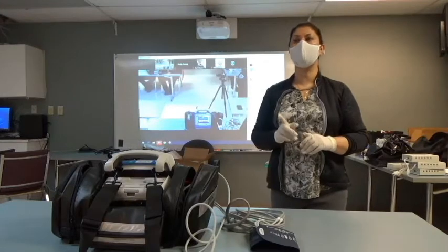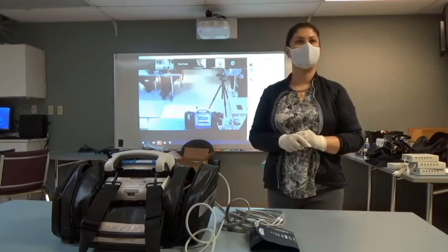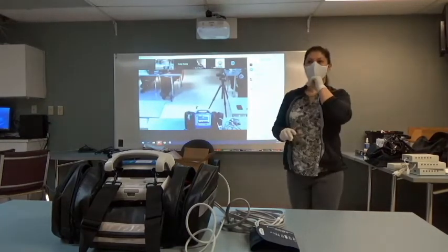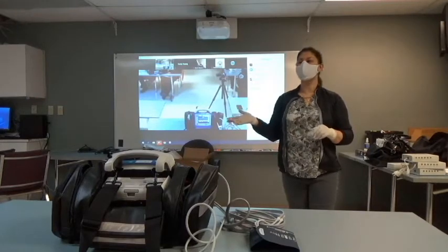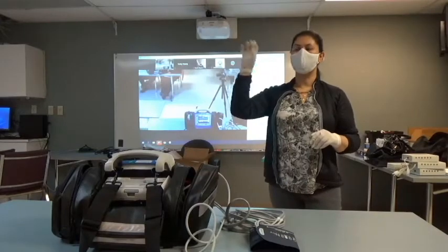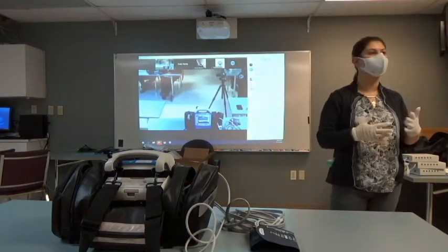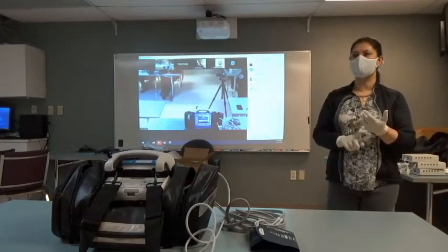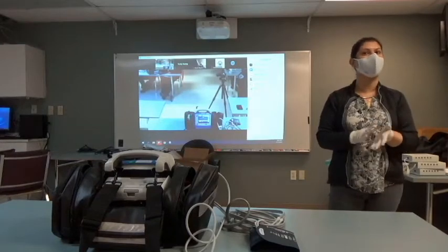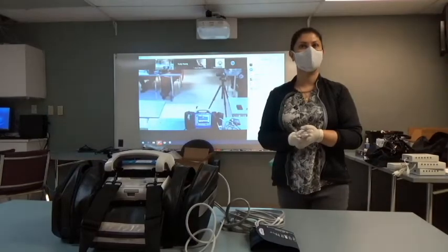Press the printer door? Yep, printer door, or if we're busy and we can't get to it, what else can we press besides the off button? The alarm button. The alarm button, very good. So what this is doing is it's triggering an equipment alarm. That's a yellow light, yellow message, just to say, hey, pay attention to this. It's something you can fix. The electrodes came off, the pulse ox came off, the printer door is open, something equipment related that I can fix. Any questions about that?